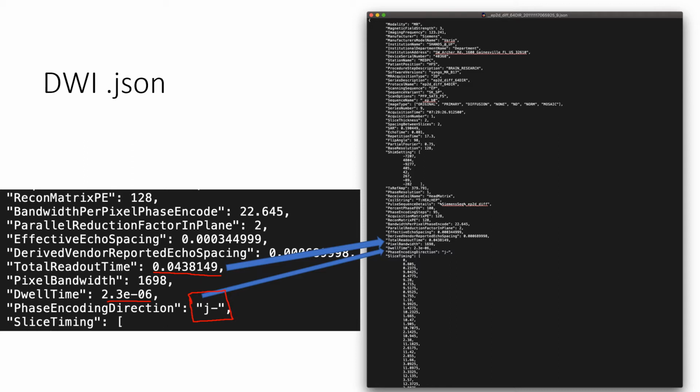So if you have a J minus for most of your images, you can do another short scan that would be a J plus. That means you have warping primarily in the front of the brain in one, and in the back of the brain in the other, and you can use that information as you put the scans together to really cancel out the warping.